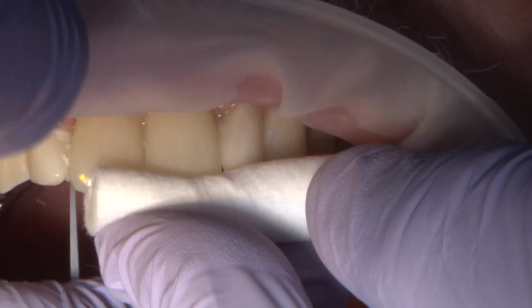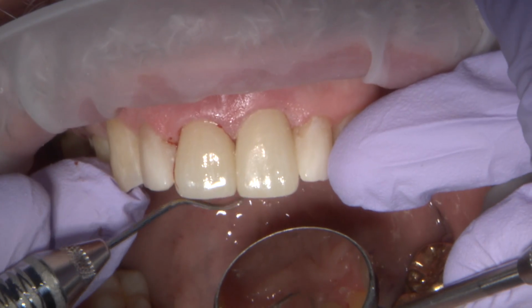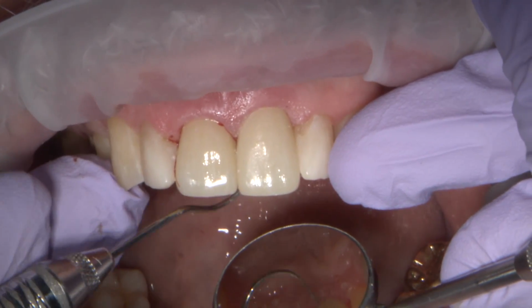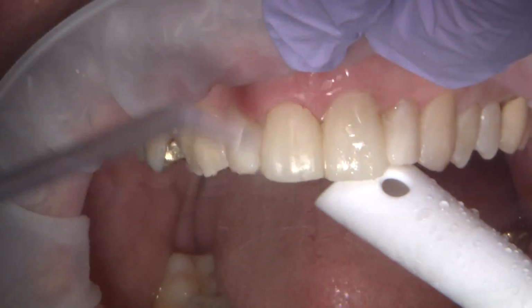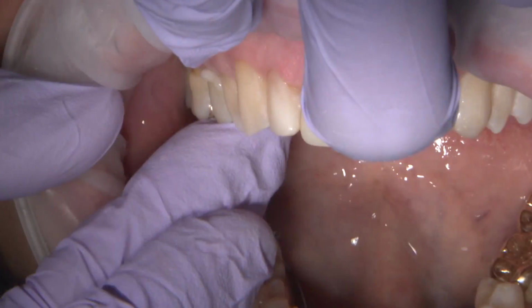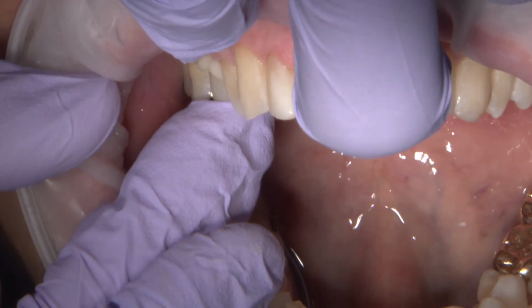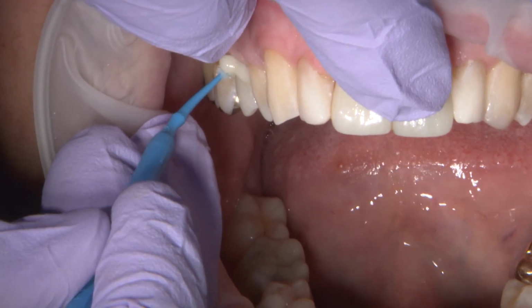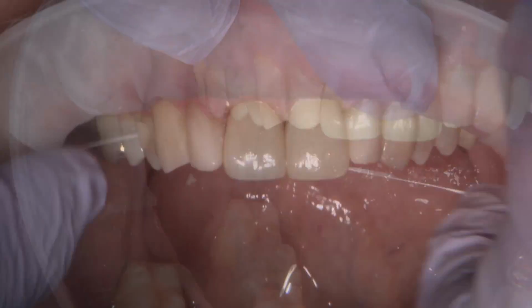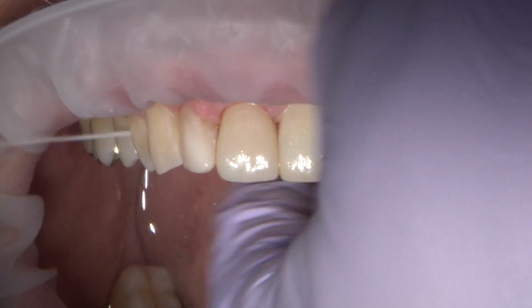So once they're placed, we go through a similar cleaning sequence. We will tack cure along the margins and remove any of the gelled cement that remains. We also bond in number 4, following a similar sequence, place the cement, and we remove some excess with a microbrush, tack cure, and then ensure that all of the interproximal cement has been removed as well.